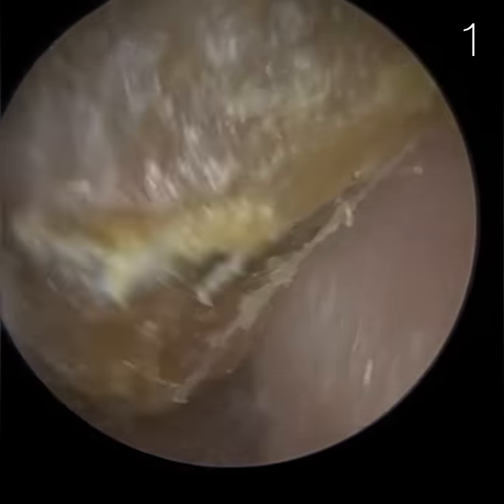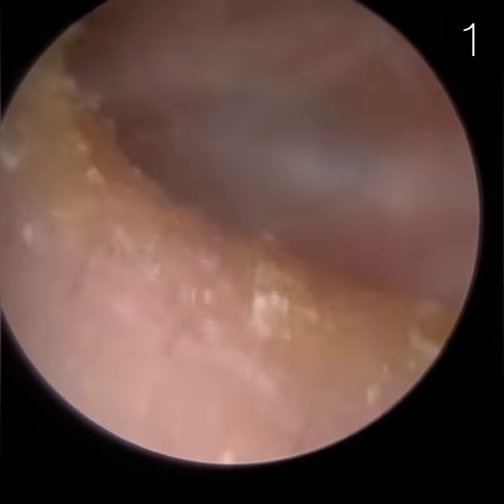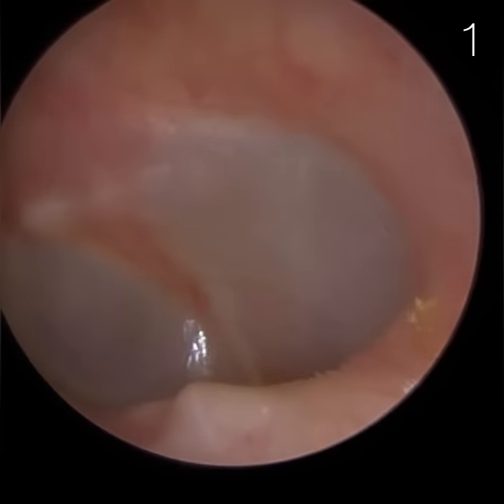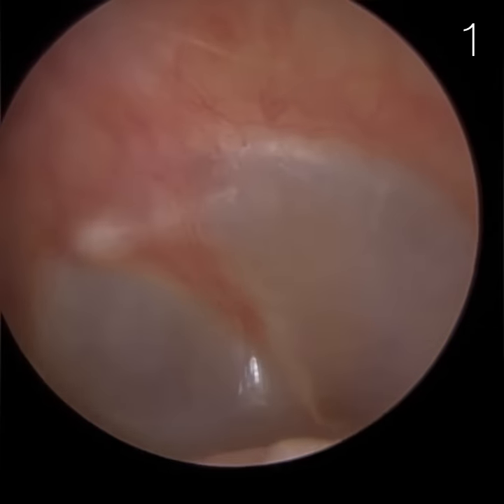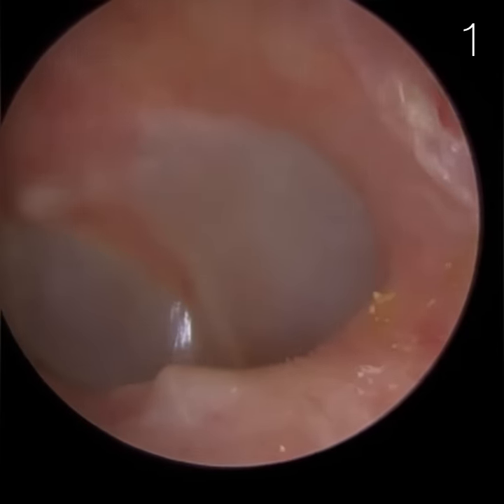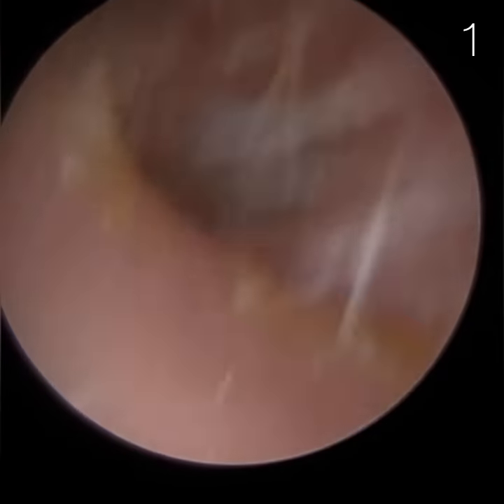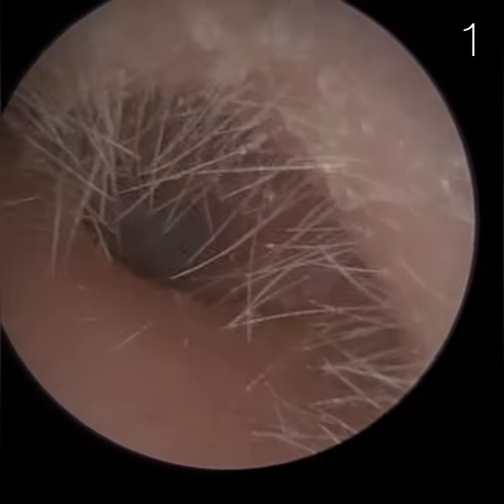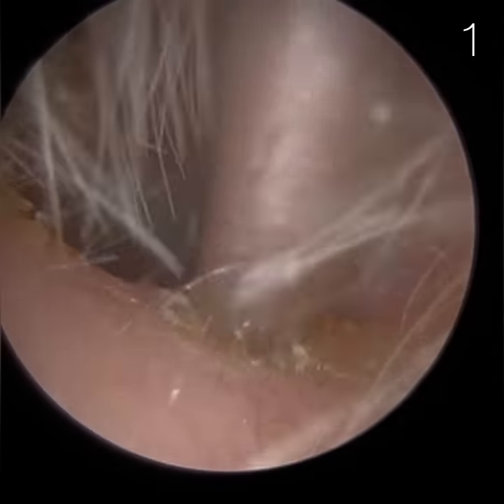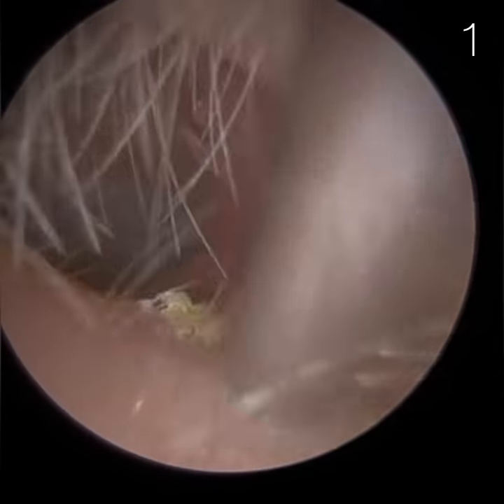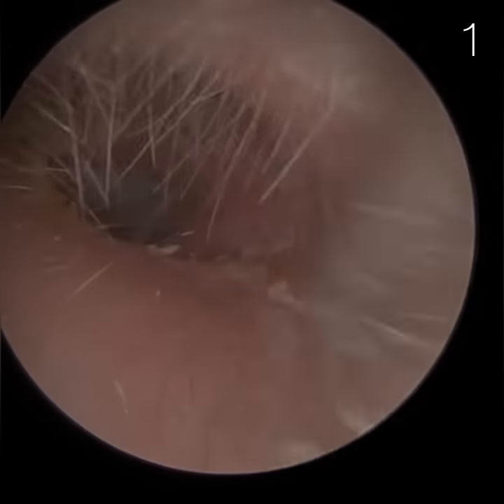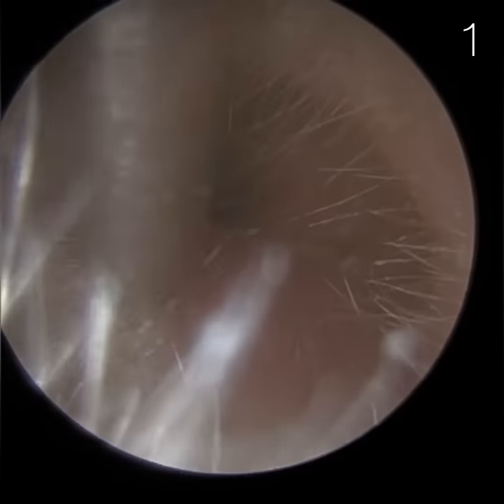We're just giving it a little wriggle, and you can see we've extracted that in one large piece. It's quite a dry, solid piece. That's the patient's eardrum. You may see this patient's got a bit of a bony spur, or even a couple, just at the base of the ear canal. It's not going to cause them any problems, but sometimes in patients you see these slight abnormalities.